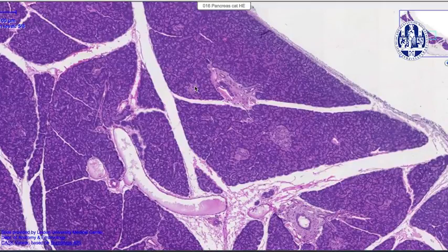And you can see the exocrine tissue which shows as purple islands, called lobules in different sizes, like the ones you can see over here. And all this tissue, this purple tissue, which you can clearly see over here. They are separated by connective tissue walls or septa, which you can clearly see over here, and over here, and over here. They support the tissue and guide the vessels, nerves and ducts. You can clearly see a big vessel running along the septum over here.